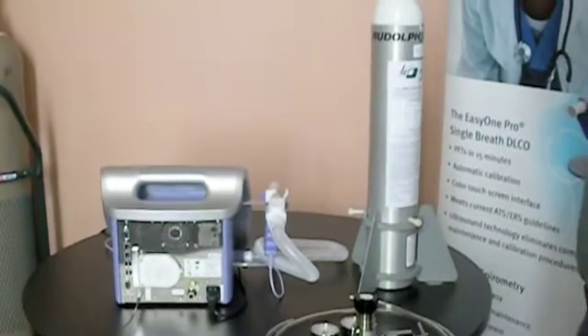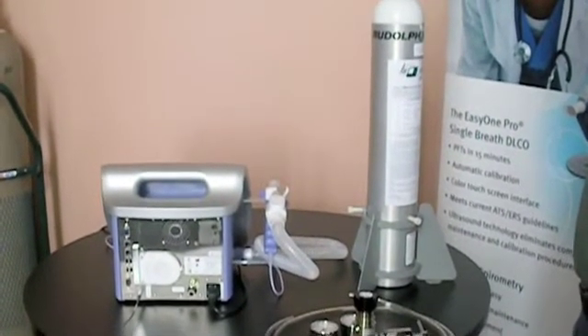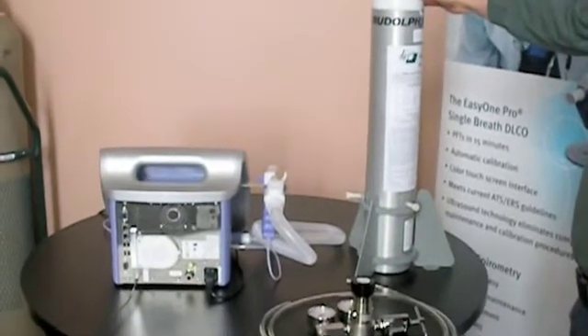This is our NDD Easy One Pro pulmonary system. We're going to connect the DLCO gas from a small E-size tank.